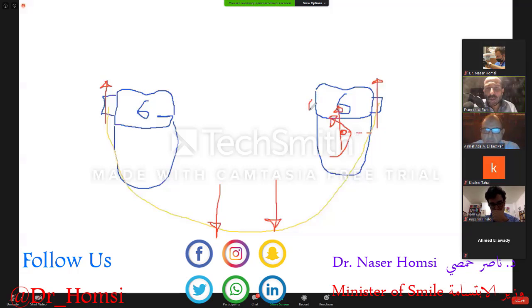For this reason, it can be considered the indication to use a lower lingual arch, that I draw this way. I hope I answered the question. No, it's clear. It's clear for us.